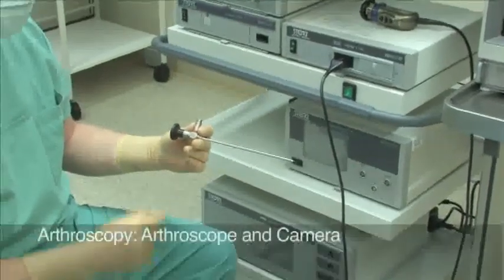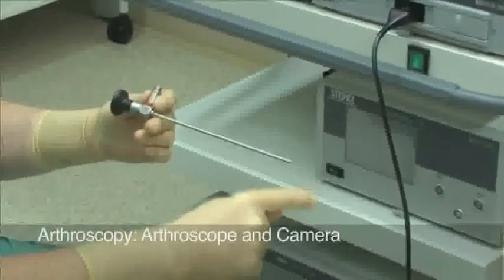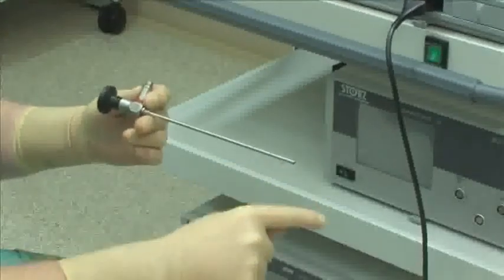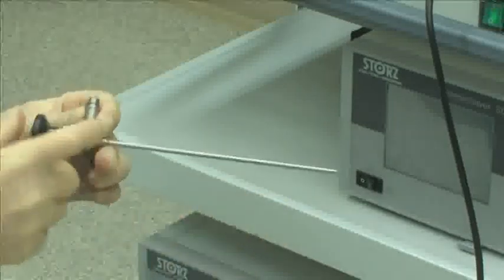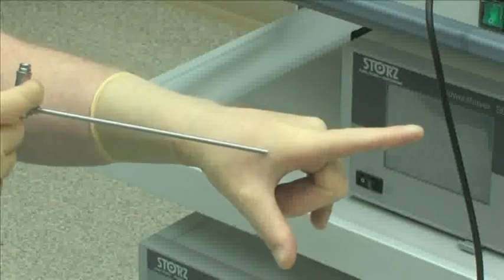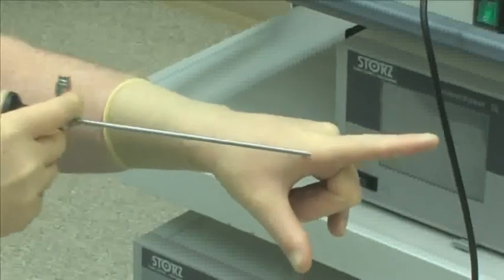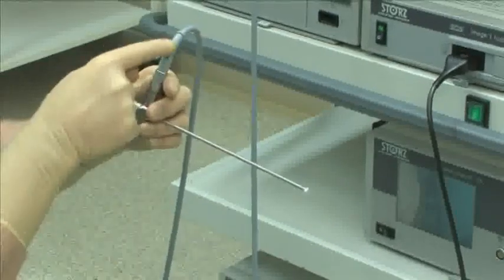For arthroscopy, we use a 30-degree endoscope, meaning that the direction of view is 30 degrees in relation to the endoscope shaft. The total field of view is more than 90 degrees, thus our sight line includes the axis of the endoscope shaft.